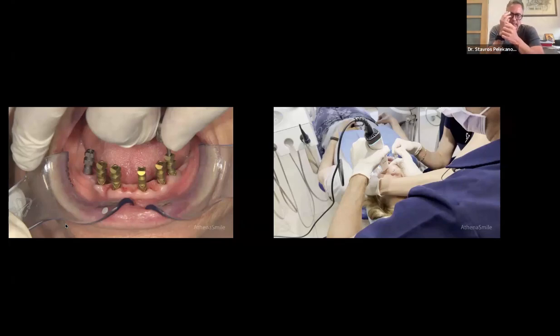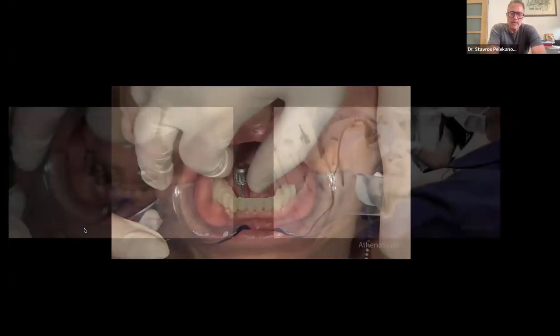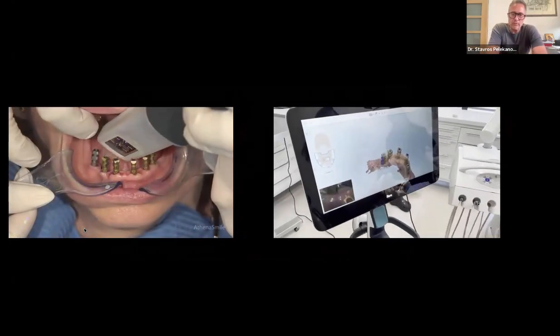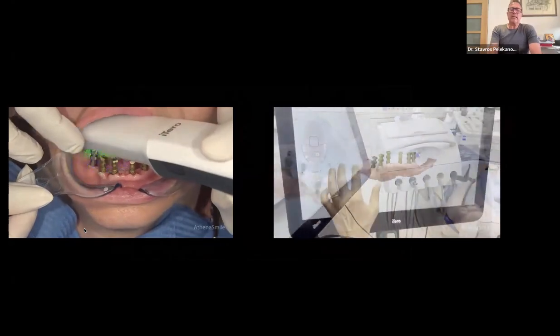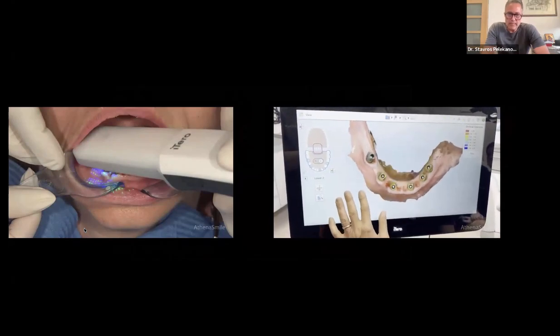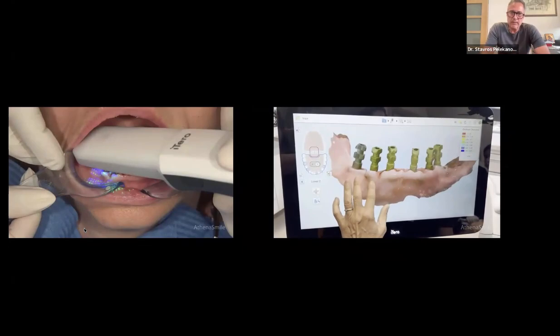In terms of scanner, I would say that according to the literature and what we have already tried a lot, when we're talking about scanning scan bodies, we're using the Lumina scanner from Itero, which, when it comes to immediate loading, or let's say a PMMA material or a material that is a little bit flexible, is extremely accurate.